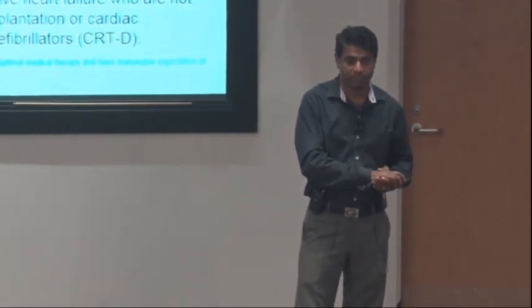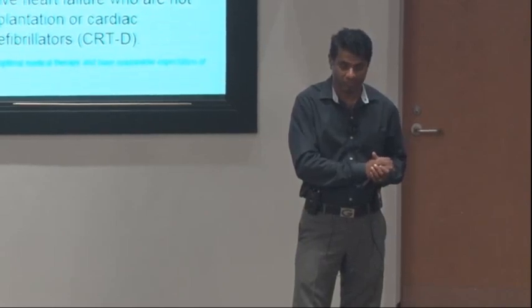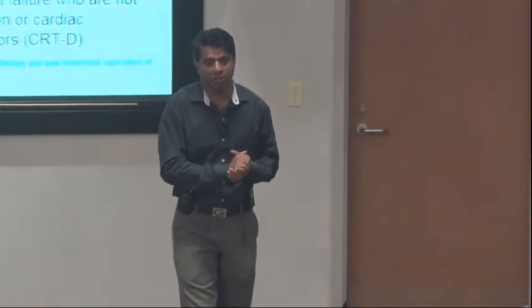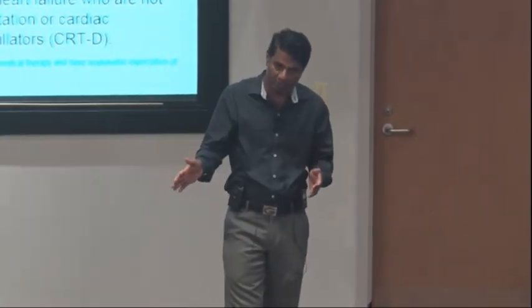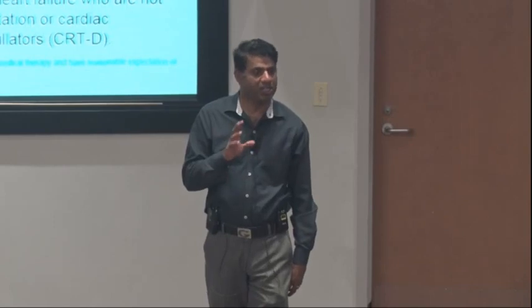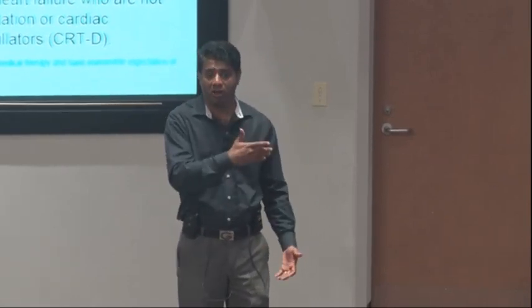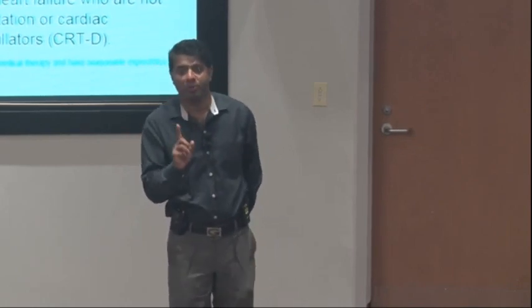We get this question all the time in the exams: patient comes in with recurrent shocks, and you do an EKG, what do you do for recurrent shocks? If you have recurrent ICD shocks, the questions could be multiple things. The recurrent ICD shocks could be appropriate shock or inappropriate shock. If they tell you it's an inappropriate shock, the lead fracture, recurrent shock, and the patient is shocking, you obviously call the device company guy to come and turn it off for now. If you want to stop shocking on a patient immediately, right then and there, what would you do?